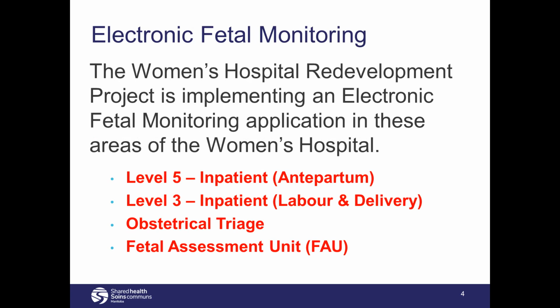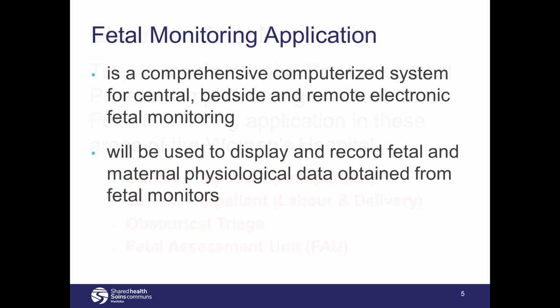The Women's Hospital Redevelopment Project is implementing an electronic fetal monitoring application in areas of the Women's Hospital, including Level 5 Inpatient Antepartum, Level 3 Inpatient Labor and Delivery and Obstetrical Triage, and the Fetal Assessment Unit. The fetal monitoring application is a comprehensive computerized system for central, bedside, and remote electronic fetal monitoring. It will be used to display and record fetal and maternal physiological data obtained from the fetal monitors.